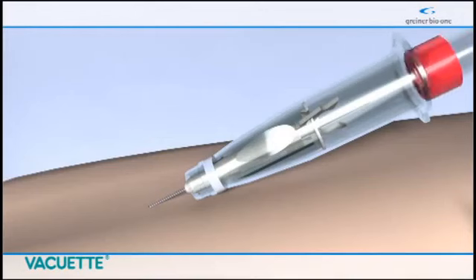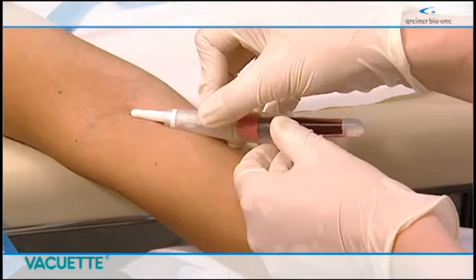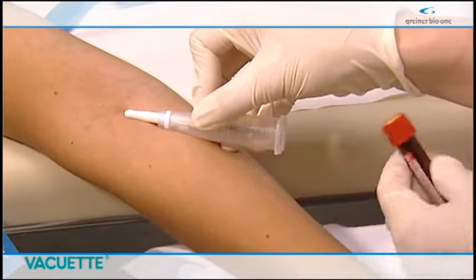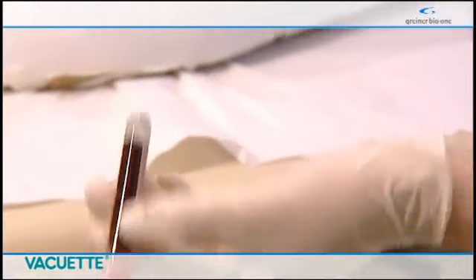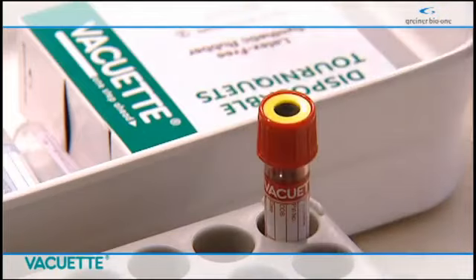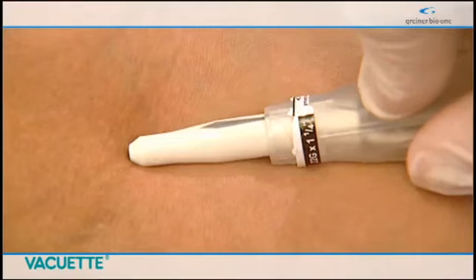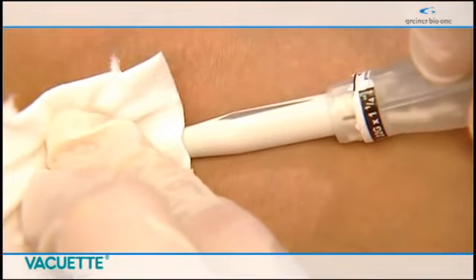By applying light pressure until the rear tip of the needle penetrates the rubber part of the cap, automatically activating the needle protection shield. The shield remains flexible for adjustments even after activation. Once the tube is filled completely, remove it from the holder and gently invert four to ten times. Please observe the recommended order of draw for blood collection if several samples are being taken.